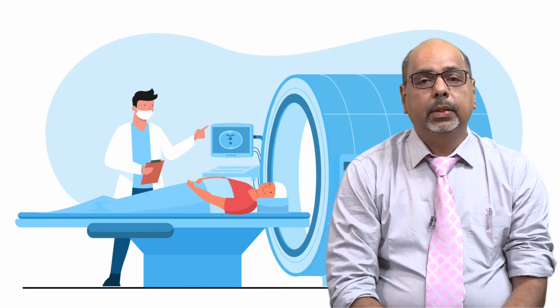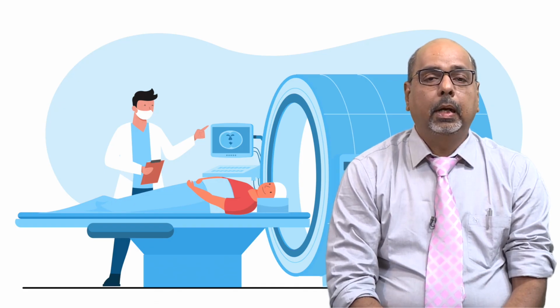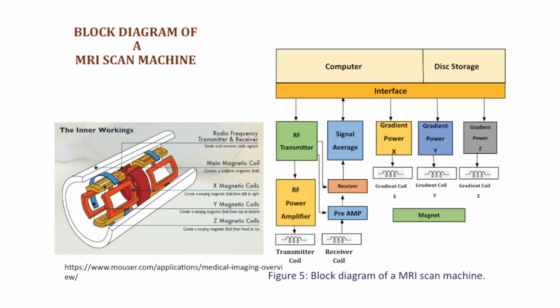Figure 6 illustrates the inner working of MRI system. You can see within the metallic cocoon of an MRI scanner, the patient is surrounded by 4 electromagnetic coils and the components of a transceiver. Patient wears loose clothing, must empty pockets of metallic objects that could prove harmful if moved by magnetic force.